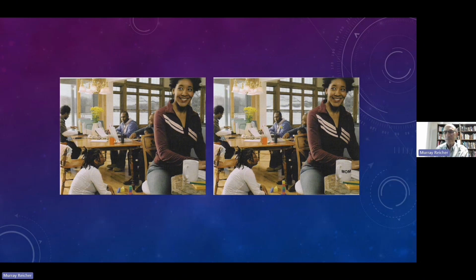I mean, I think in 15 or 20 years, we're going to look back at this era and find it almost unbelievable that radiologists spent their day first eyeballing images to look for the anomalies and changes. That's going to be done by a machine. After all these years of training, the typical radiologist, I think, should spend their time analyzing not whether there's a finding, but the significance of the finding and what it means with regard to the patient's diagnosis and recommendations for therapy. But at any rate, while I've been talking, you've had an opportunity to look at these two images and hopefully see some of the differences.